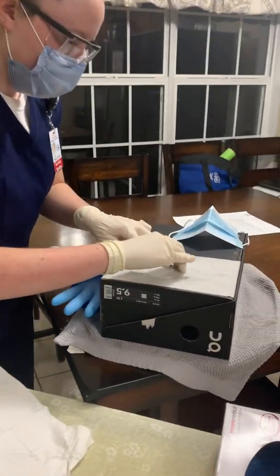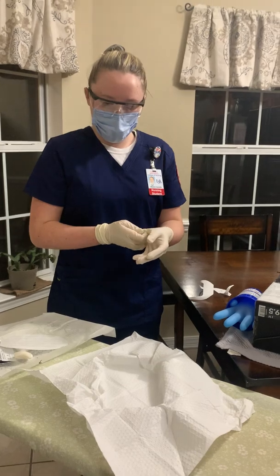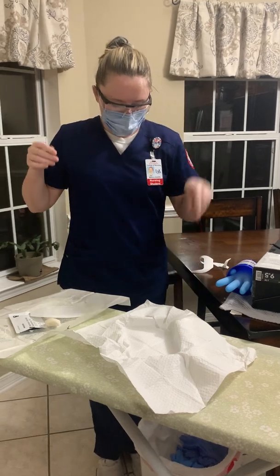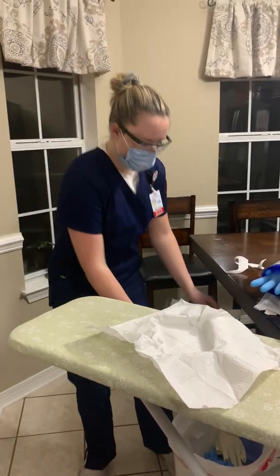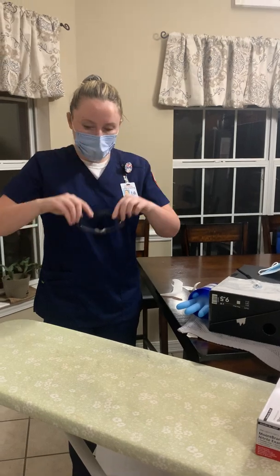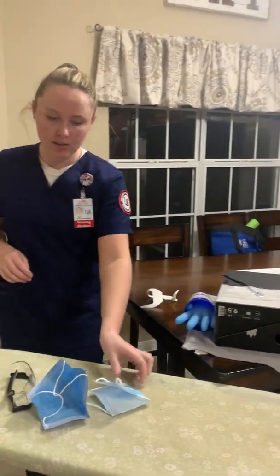So again, making sure all the sides are down. Okay, and after I've done that, I can go ahead and take off my sterile gloves, glove to glove and skin to skin, and throw those away, as well as cleaning my area. So throwing all this away, and performing hand hygiene. And then I can go ahead and take off my goggles and my mask, and then take off the patient's mask.